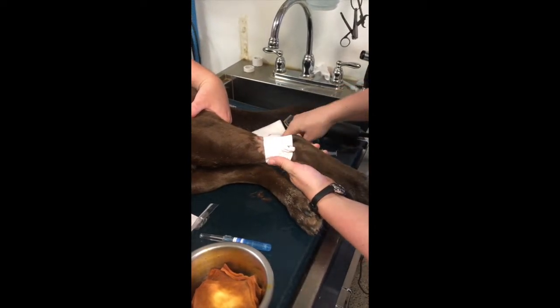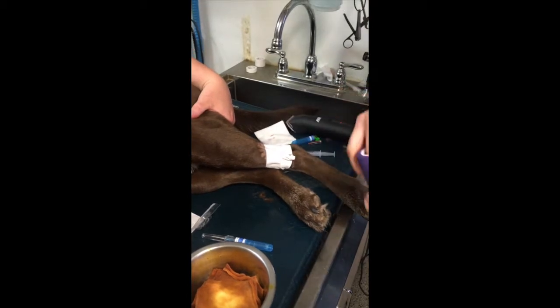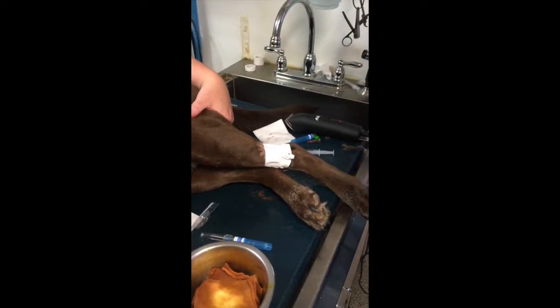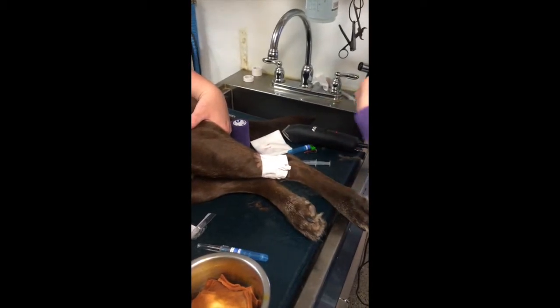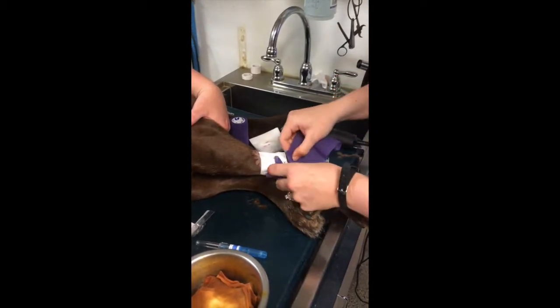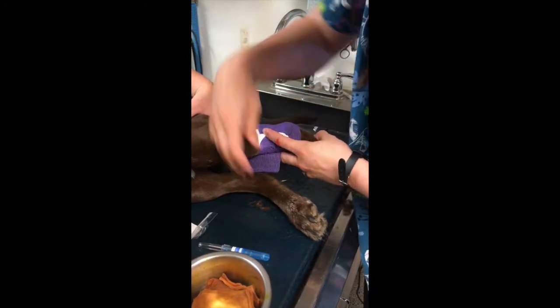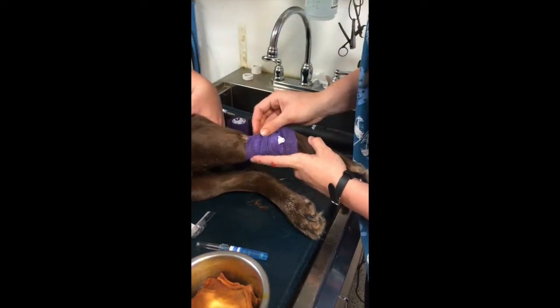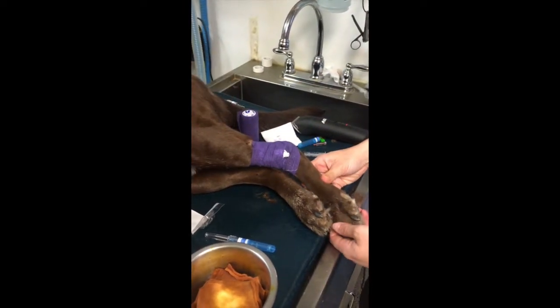All right. Once that is done, I'm going to go ahead and take some vet wrap, and I'm going to cover the catheter to keep it secure and safe. I want to make sure I leave the injection port readily available. And that is how you place a lateral saphenous catheter.